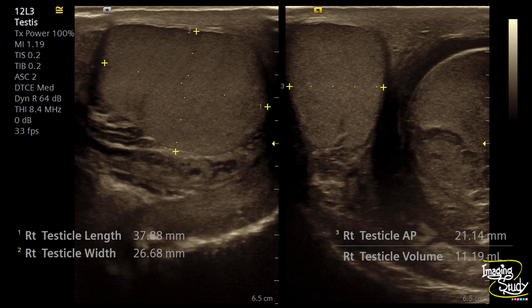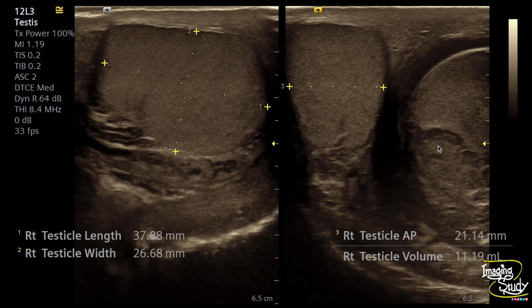Here you can see the still picture of the right hemiscrotum containing a normal right testis and part of epididymis. The scrotal skin is quite normal here. On the left image you can see the longitudinal section and on the right image the transverse section, and you can see there is an asymmetry between the two testes.